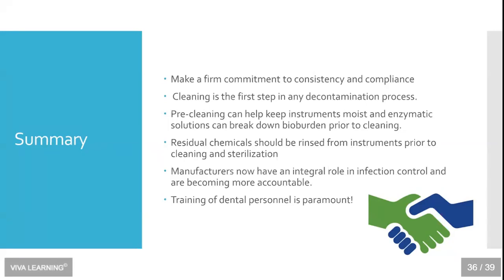Pre-cleaning is a great first step to keep instruments moist, and enzymatic solutions can help break down bioburden prior to cleaning. If you are in a high volume practice, that may be an excellent option for you. Anytime you use chemicals in the cleaning or sterilization process, they must be rinsed from the instruments prior to the next step, whether it be cleaning or sterilization.